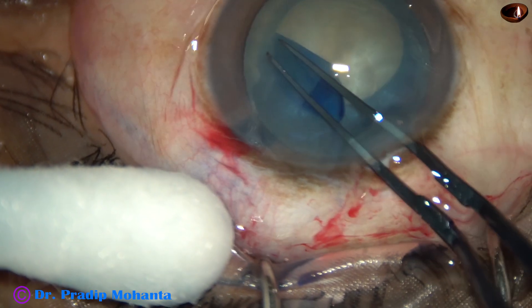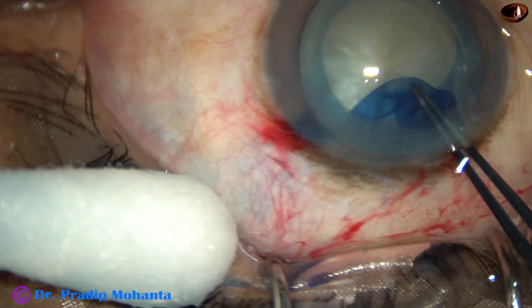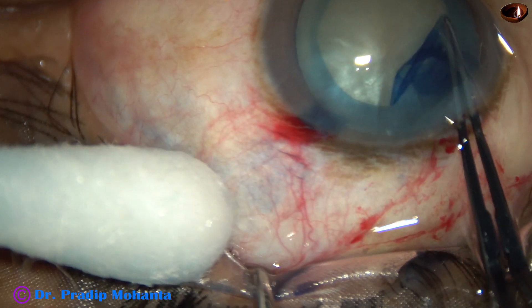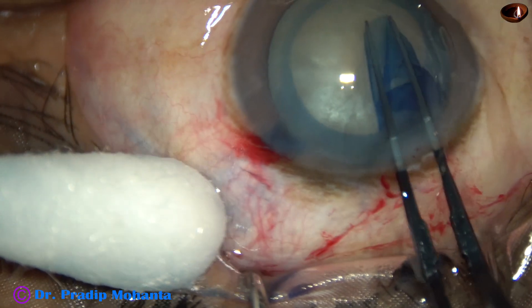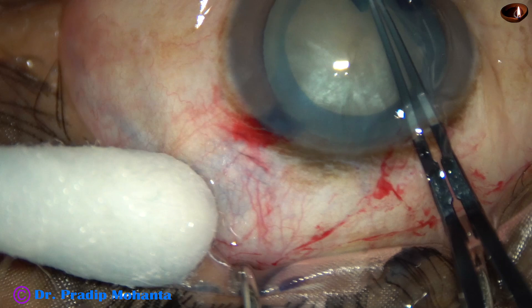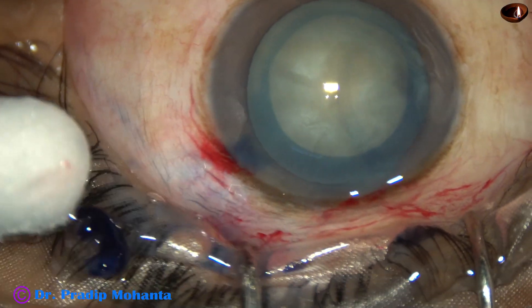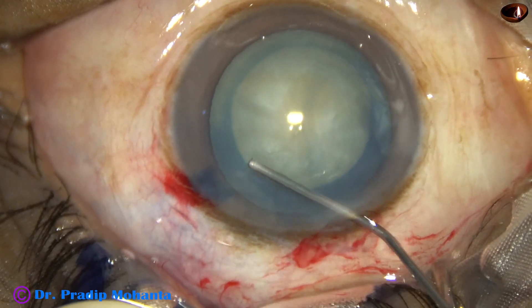But there is no harm in doing twisted rhexis even in such cases where there is convexity of the cataractous lens. Rhexis is done. This is a nice 5mm rhexis.